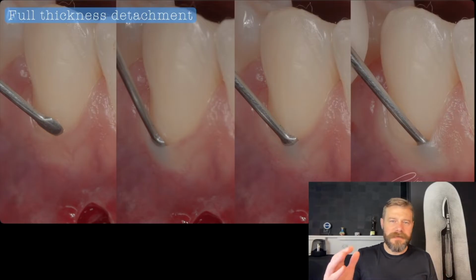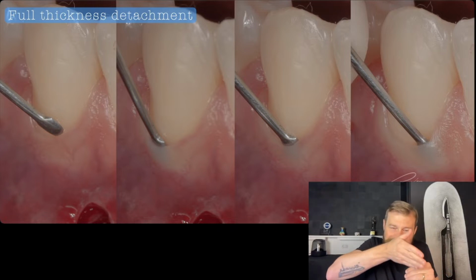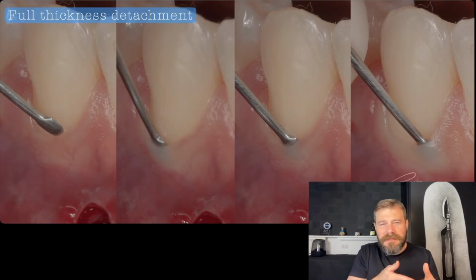So most of the cases that you are handling are exactly this clinical situation that you have. Using a blade, even using a microblade to execute this step, can compromise the structure of this tissue. An incision inside the sulcus in a circumstance like this one can really make this thin phenotype even thinner. You make this incision inside the sulcus, take the epithelium from inside, and this may compromise the structure of this margin, and sometimes you lose the flap during the healing stage.